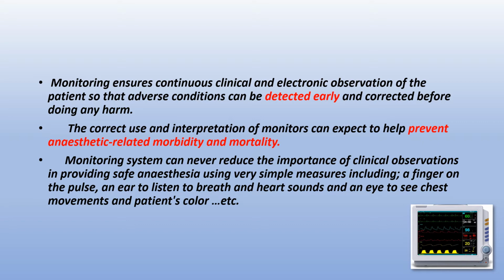Monitoring systems can never reduce the importance of clinical observation in providing safe anesthesia using very simple measures, including a finger on the pulse, an ear to listen to breath and heart sounds, and an eye to see chest movement and patient color.